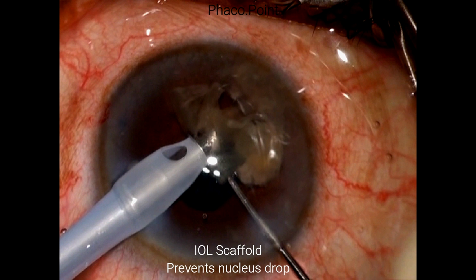Another possibility that we could consider here is performing an IOL scaffold, that is, placing the proposed IOL in the anterior chamber over the iris prior to emulsifying the nucleus, with a view of helping prevent a drop of the nucleus into the posterior segment.